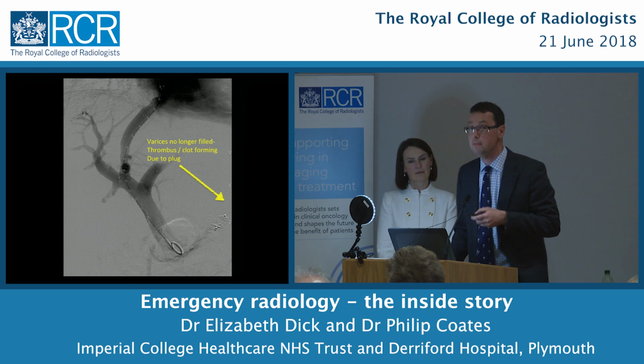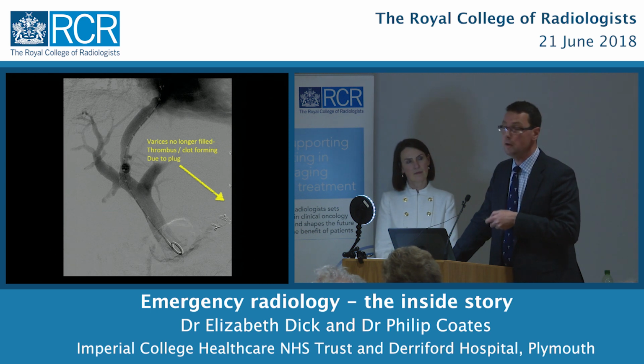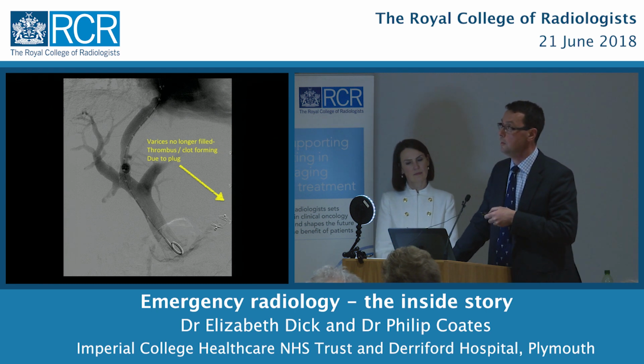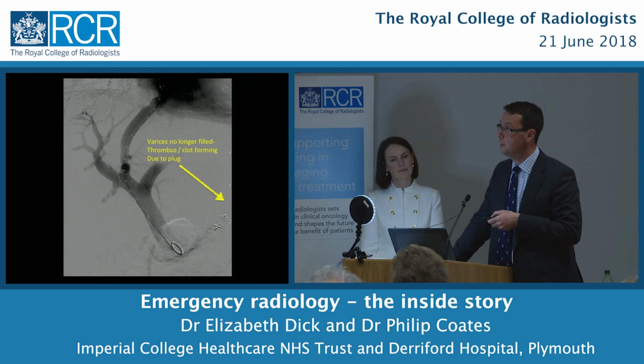So we'd expect fairly immediate improvement with this stent graft in place with the portal venous hypertension being relieved and the pressures returning to normal. We very often have to go back and sometimes re-balloon these and make sure they're functioning. We did in this case as well. And that the pressures here are as expected. But this is a literally life-saving treatment, having decompressed into the systemic circulation.